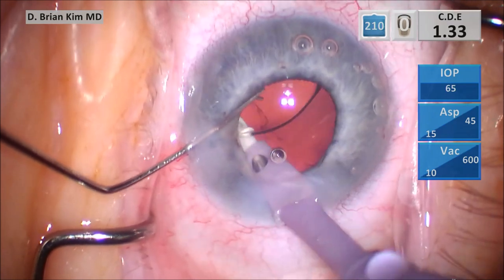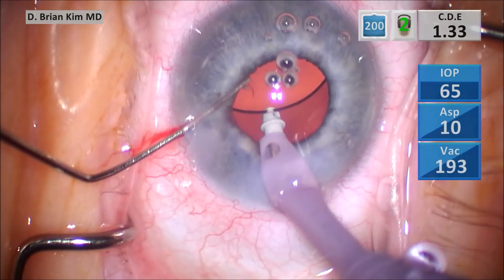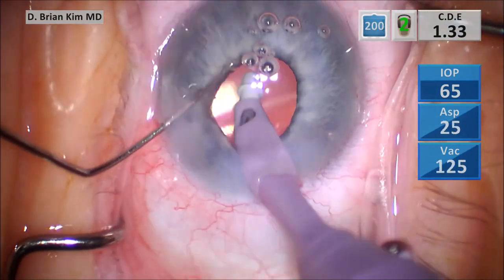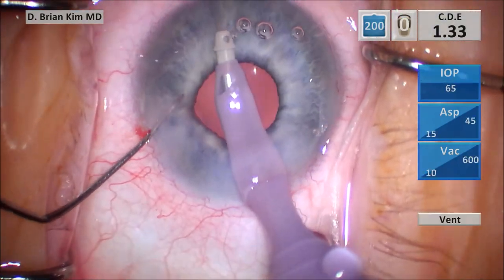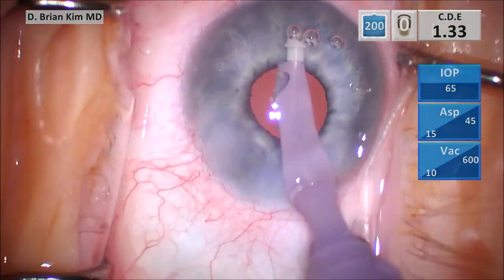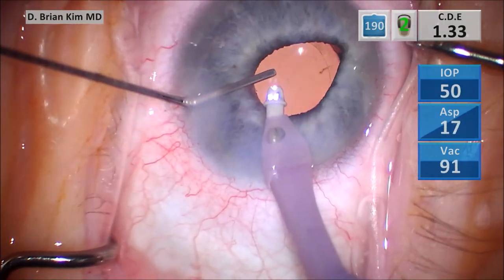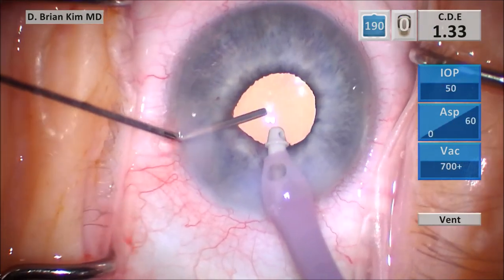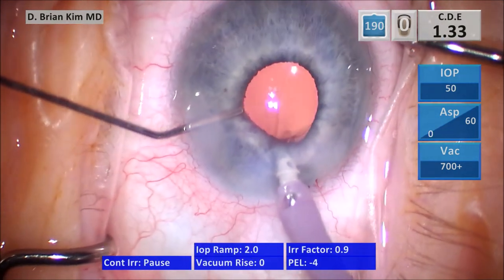I'm able to tilt this lens, go underneath it, remove the viscoelastic from within the bag, and then remove the viscoelastic in the anterior chamber. I'm very confident the lens is completely in the bag because I was able to use the Maltzman to visualize that. I'm then removing all the viscoelastic in the anterior chamber. Because I used viscode, I have to be very careful to make sure all the viscode is out of the anterior chamber as well as out of the angle. As I pull the IA out, I disengage irrigation, then pull out and hydrate my incisions. This is a very, very small pupil and very unstable iris.